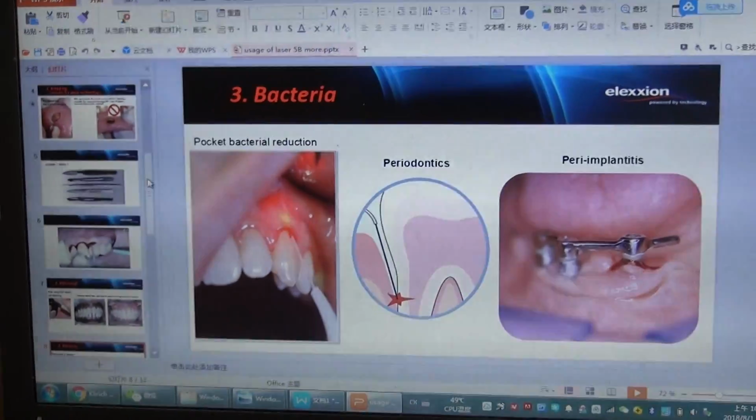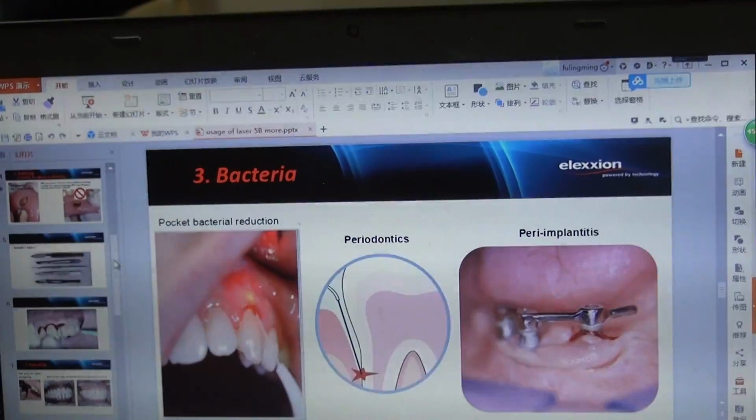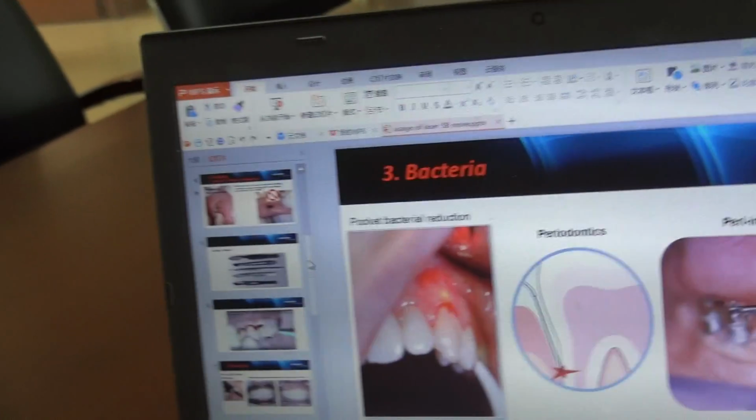Because I know some jobs that we do with piezo surgery, we can also do with traditional tools. For example, the drill. We can make a hole in bone with a drill, and a drill is quicker than piezo surgery. I also know piezo surgery has some advantages that the drill doesn't have. The problem is piezo surgery is slower.